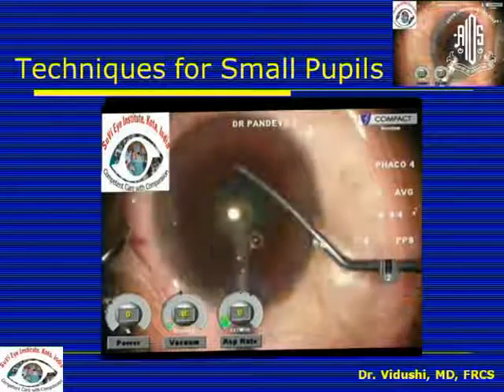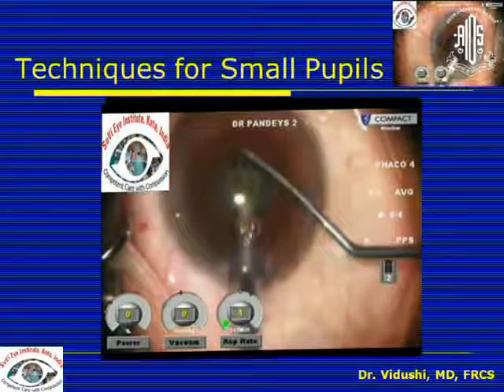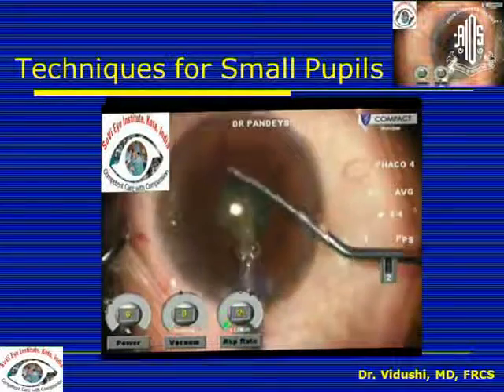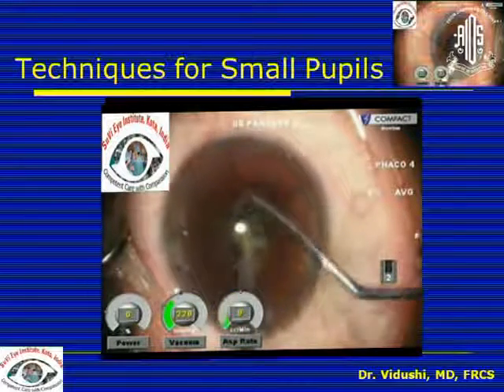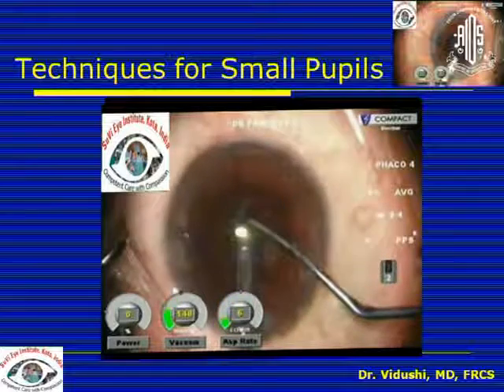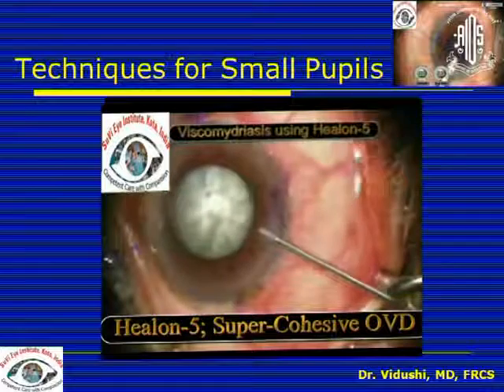The one thing that must be done in all these cases is to do a slow motion FACO using low parameters so that your viscoelastic stays in the anterior chamber. It also helps to maintain dilatation of the pupil. Do not try to struggle in a pupil as small as this because that will increase the chances of complications.